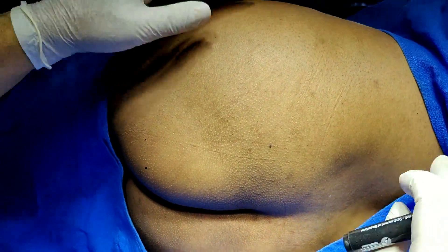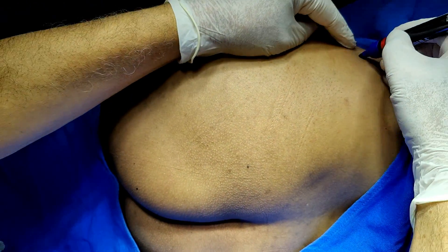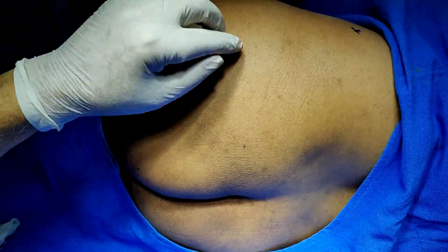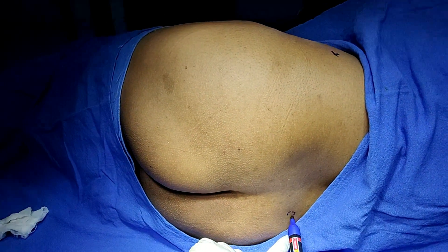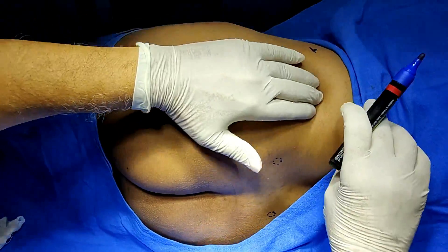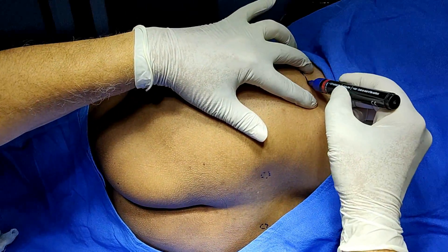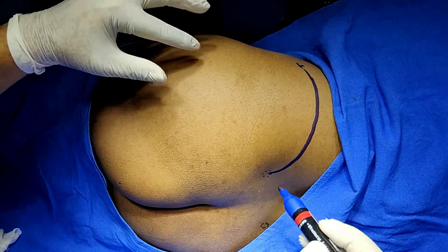We are marking certain landmarks. First, palpate the iliac crest — this is the top of the iliac crest. The posterior iliac spine is represented by a dimple here. We will draw part of the iliac crest from here to here.